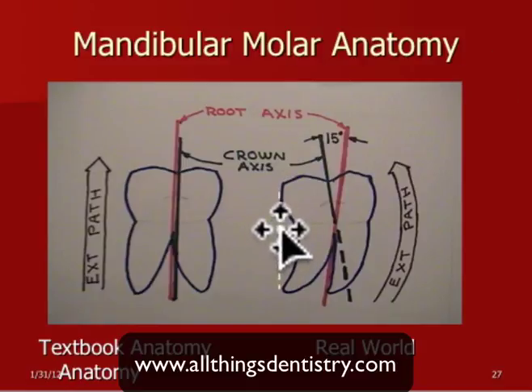The other thing I want you to note right here is a little dotted line, and you see there's a significant concavity behind the second molar. Frequently when you have mesioangular or horizontal impactions, you know where the crown's going to be. It's going to be right down in here. People, especially when they start out, are a little timid about getting down in there, but that's where the crown is, and that's where you have to go to section that tooth out.